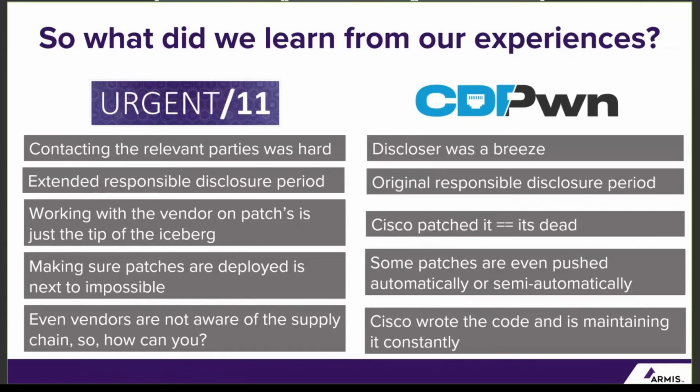You have an update right there. You don't need to talk to other makers, other vendors, stuff like that. This, as Curtis mentions, is the same case with Microsoft or Apple, which have regular patches deployed, and IT people inside companies know how to handle those patches. I bet some of you never patched your MRI machine, or your patient monitor. It doesn't happen that often, which is a problem.